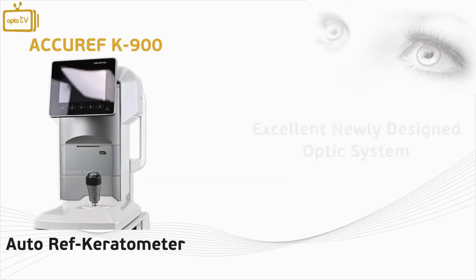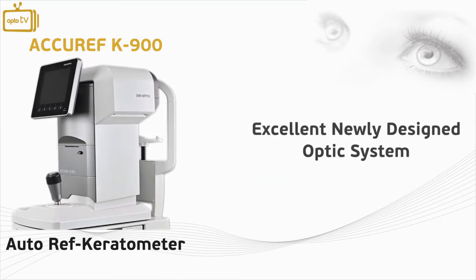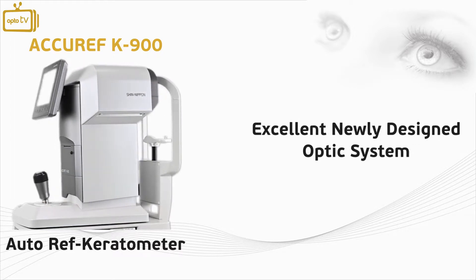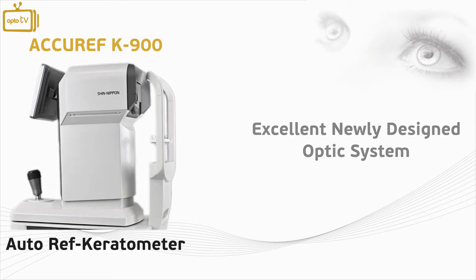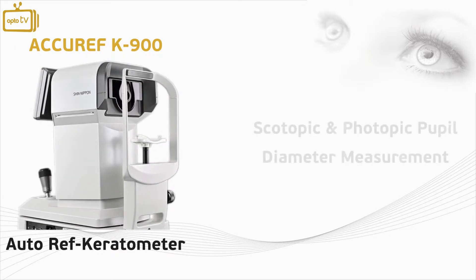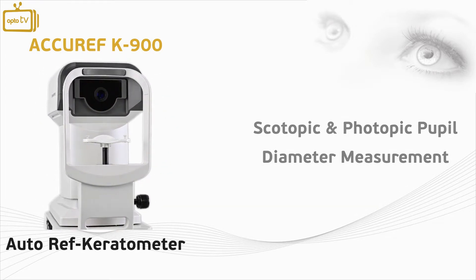The instrument has an excellent newly designed optic system manufactured in Japan, which offers high accuracy measurements at a minimum pupil diameter of up to 2 millimeters. The K900 allows the user to capture both scotopic and photopic pupil diameter measurements.